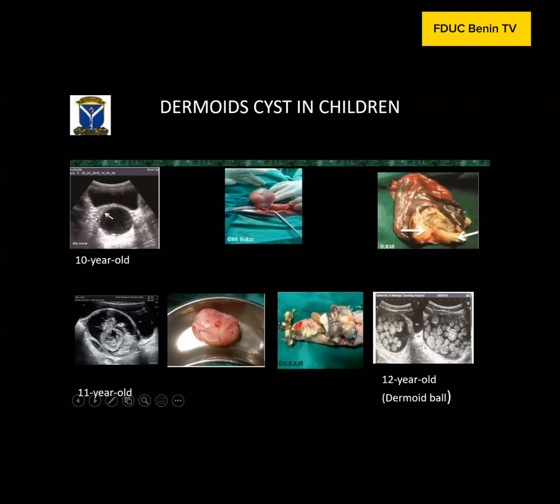Here's another case of dermoid. Look at this line, dot, dash, dot, dash. There's nothing to query here. This is hair. You can see this is fat, or you can see dot, dash within the fat, and this is a fat ball.